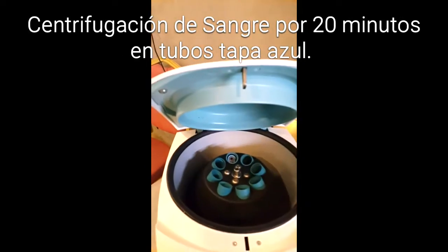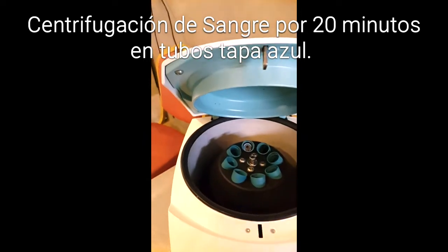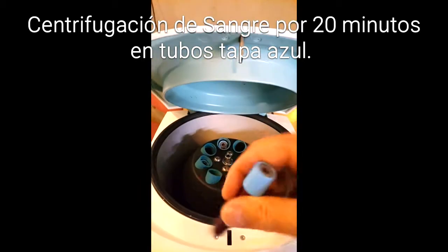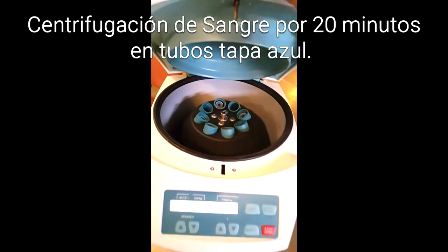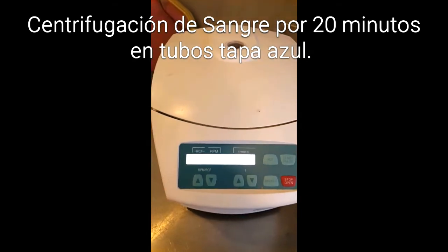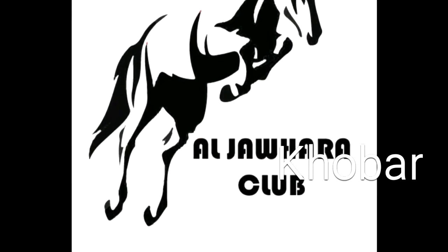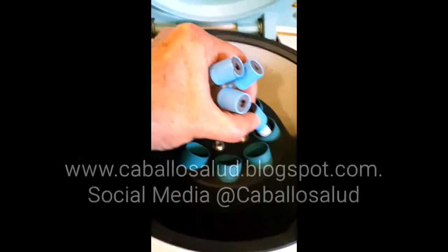I put it into the centrifuge — it is like a cross. It has to be completely balanced to proceed. Here we start with the centrifuge.